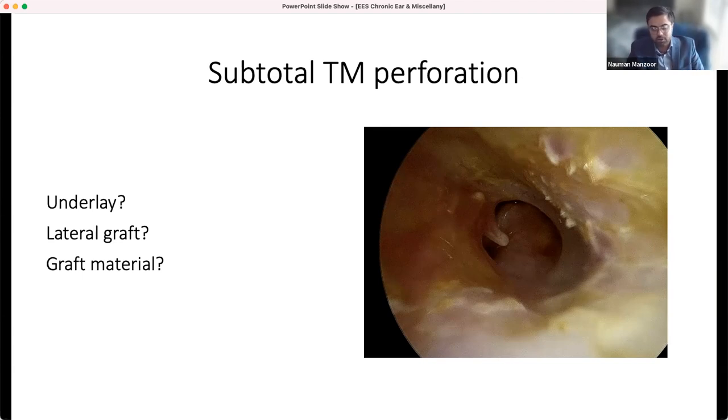If you look at traditional lateral grafting, people would cut gel foam in different sizes or cigar shaped sizes, and they'll really tuck that anterior angle. So I think in most cases you can get away by just packing it really well with gel foam. Yeah, but that pull-through technique is an elegant technique when it's executed well.